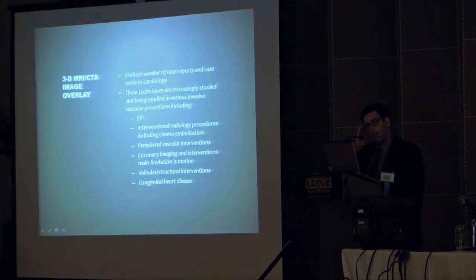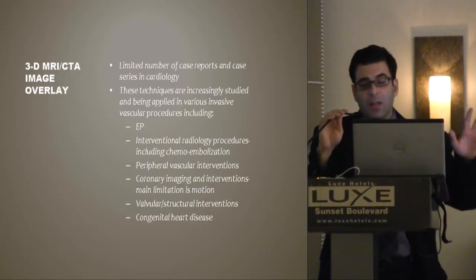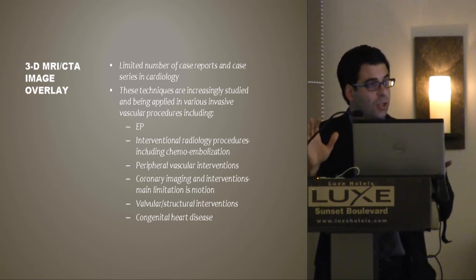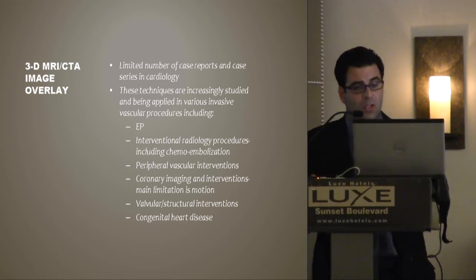Now, I want to focus a little bit on 3D MRI and CTA image overlay, and I'm going to show you some examples of that. This is relatively new technology. There are a very limited number of case reports and case series in cardiology. These techniques, though, are increasingly studied and being applied in various invasive vascular procedures, including electrophysiology. The EP folks have really led the way with some of this.